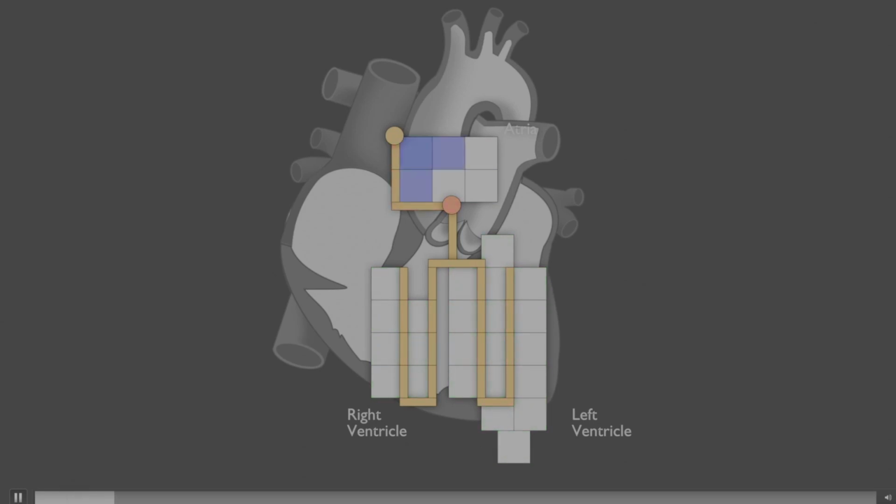I can combine those two values, the number and the direction, into a single metric called a vector. A vector is a number that has both an intensity and a direction. So in our model, that's going to be the number of blue cells and the direction that energy is moving. Those vectors are what we're actually measuring on an EKG. And in a future presentation, we'll look a lot more in depth into that phenomenon. But for the moment, understand that what we're measuring is the intensity and the direction of electrical impulses through the heart in combination.